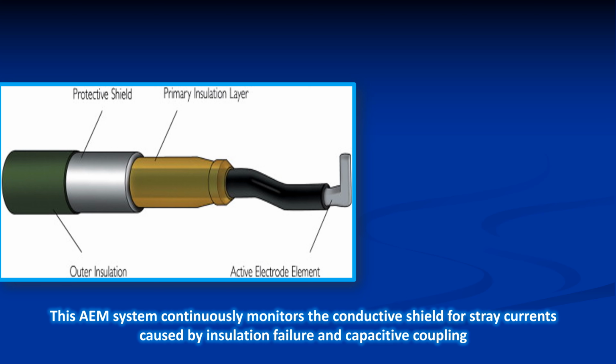So if any insulation defect or capacitive coupling occurs, the outer insulation layer will protect against it, and the current will pass through the second conductive layer outside to the electrosurgical unit to stop the working of the instrument. Although it is formed from about four layers, it can still be used with 5 mm trocars during laparoscopy.